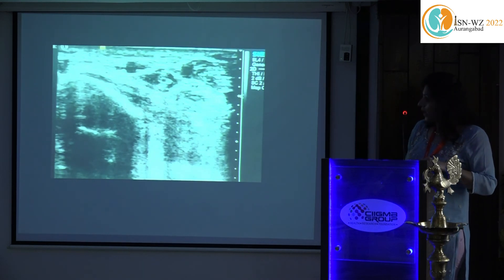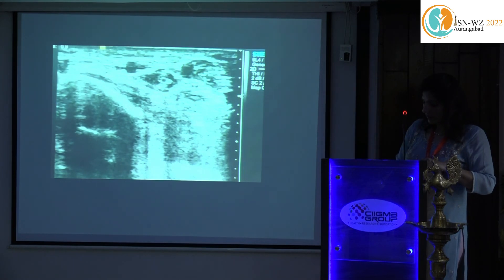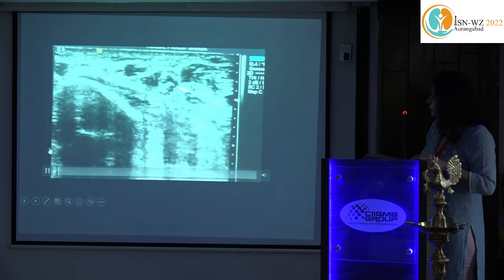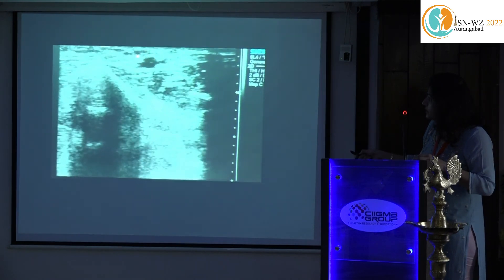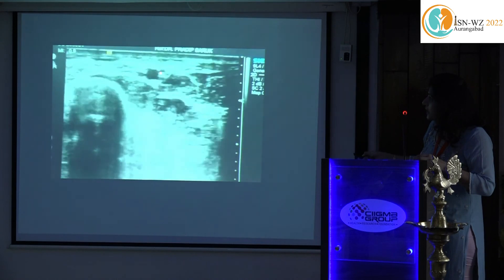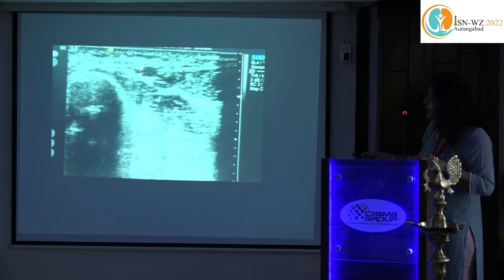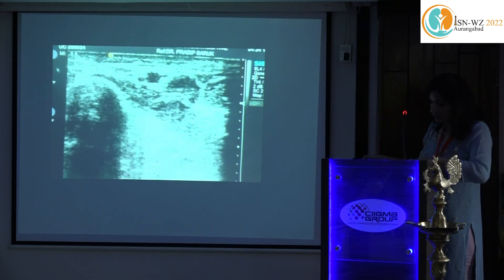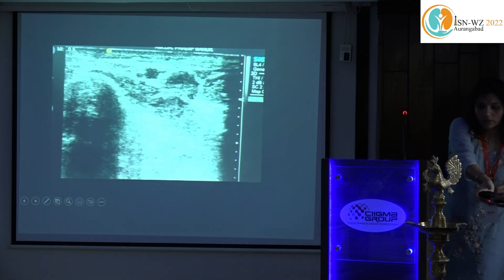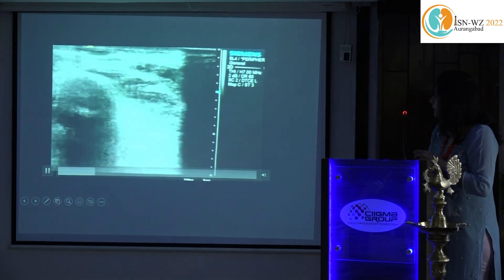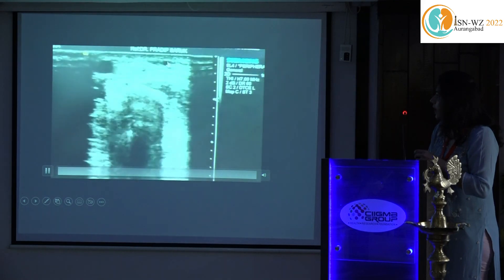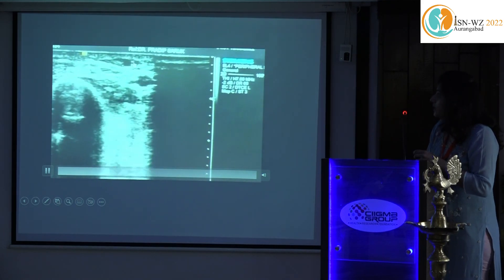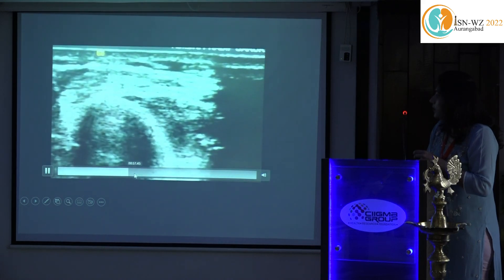Here is a short demonstration video. This is the radial artery along with the accompanying veins. You can see the pulsation of the artery — a normally pulsating artery in itself suggests it is healthy. We freeze the image and measure the artery. We then check for compressibility of the accompanying vein — the vein is completely compressible. We freeze the image and take the measurement of the vein. Then we take the arterial spectrum.